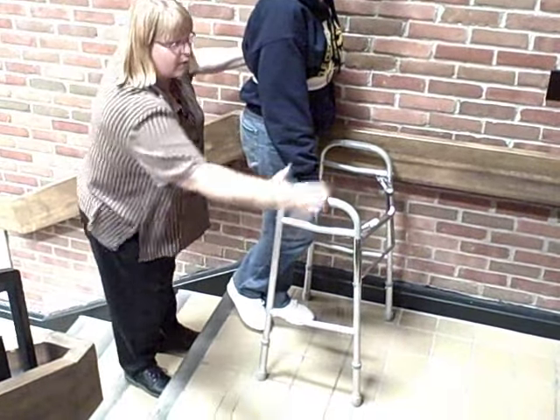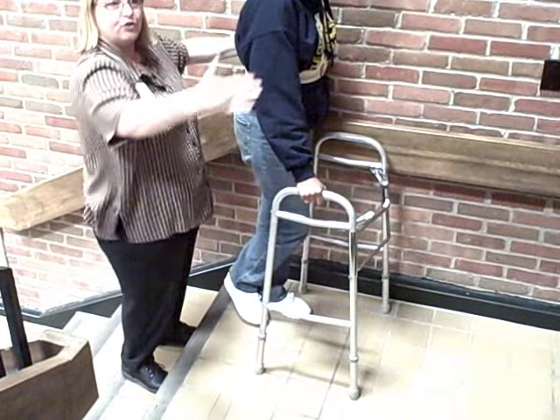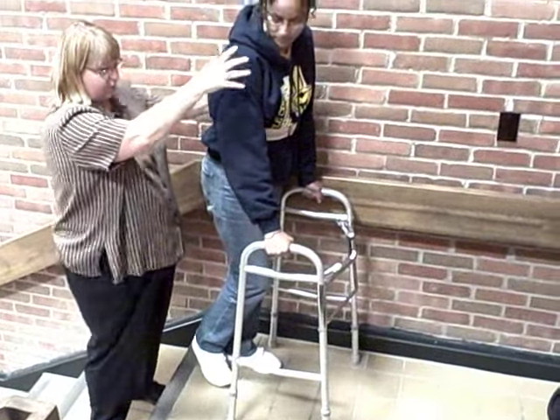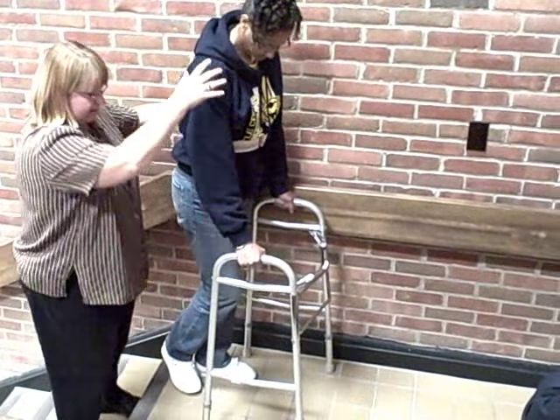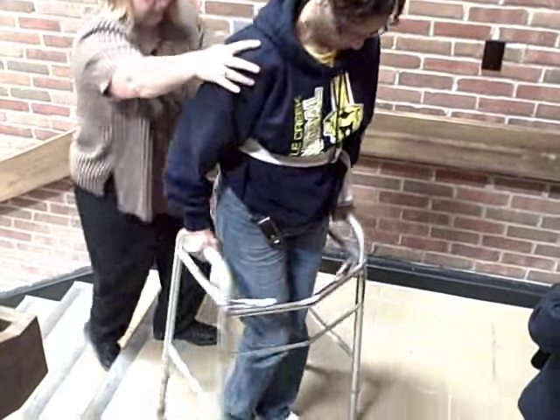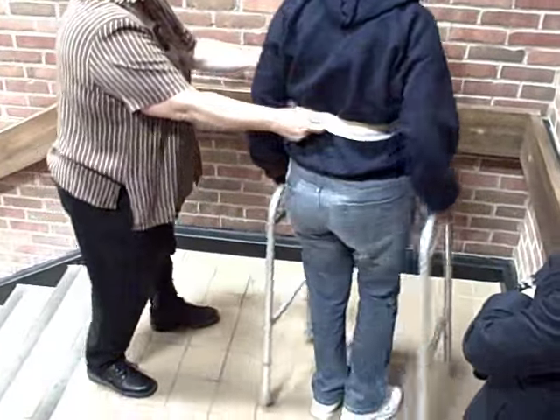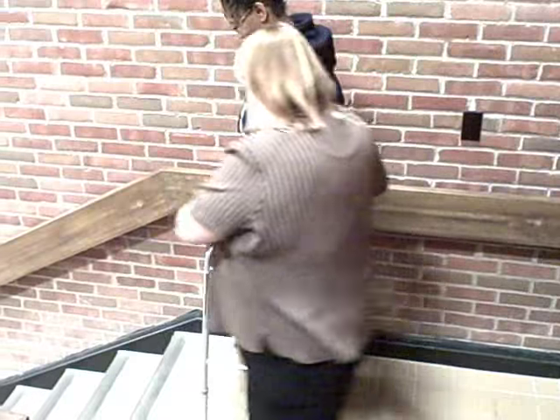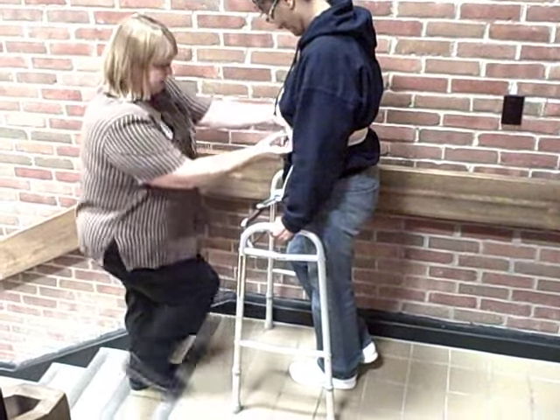This is her weak side, so we're going to go in a big circle around that way so that she can turn toward her strong side. Let's go ahead and put both hands — the weight needs to go at the same time onto the walker, so let's do a big circle there. I'm staying behind. Notice, if I did this the wrong way and I were behind her like this, all sorts of bad things could happen. So I just worked my way around her gate belt.